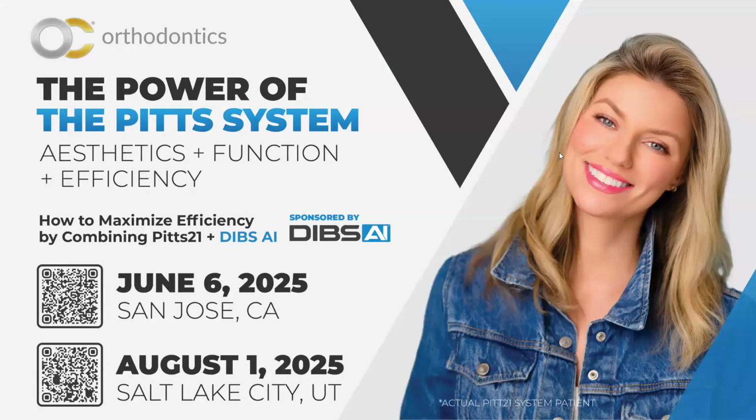So let's see. How do you communicate to your team that there will need to be extra composite or wedge on the base and on which teeth? Good question. Let me just flip forward a little bit here. I've got a couple of slides that address that.